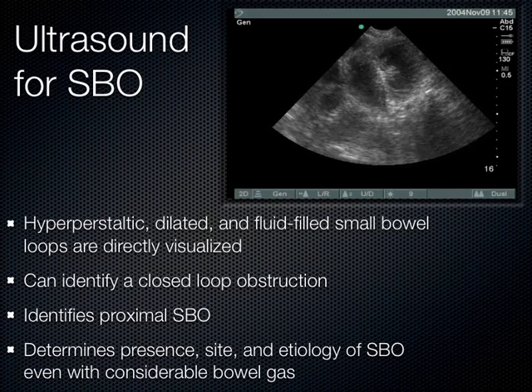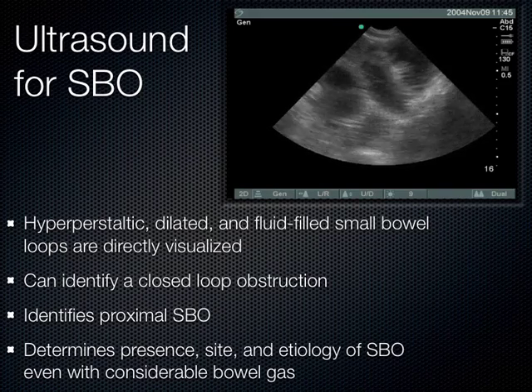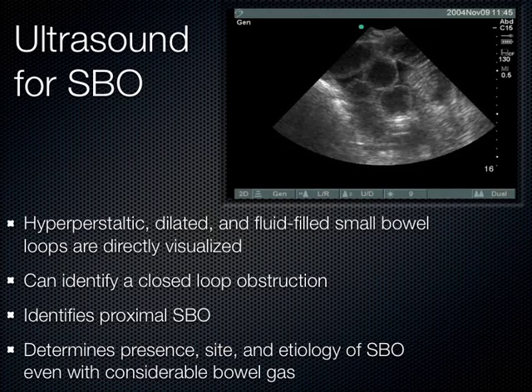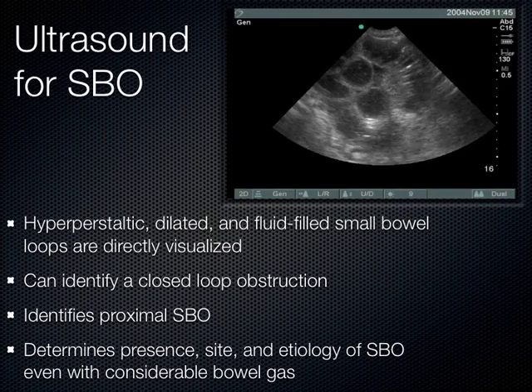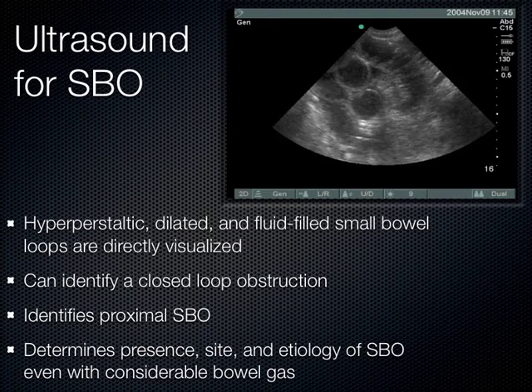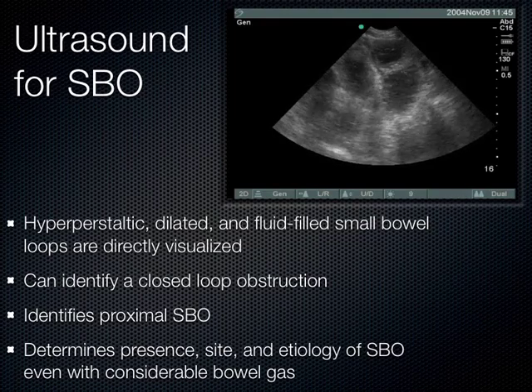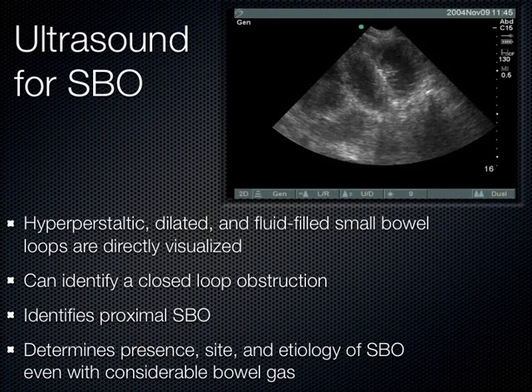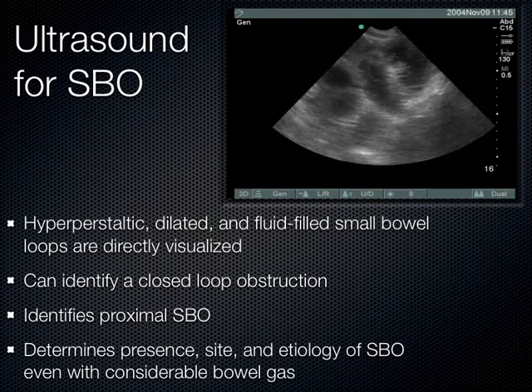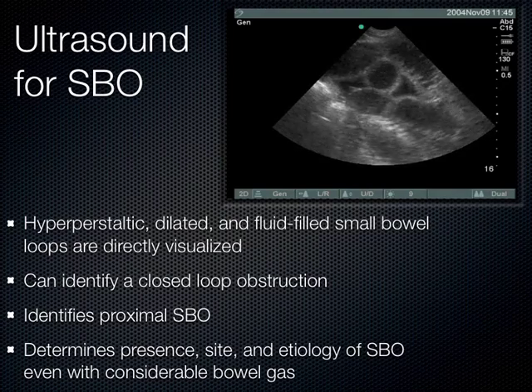And what you see with ultrasound is pretty easy to see, actually. If I've got a patient who's pretty distended, I just walk over with the ultrasound probe, they're vomiting, they've got all the clinical signs of small bowel obstruction. Well, this is what I see. I see these dilated loops here of small bowel. Notice the plicae circulares going all the way across the bowel there. The walls are usually thickened, though sometimes in an early small bowel obstruction, the walls have yet to become thickened.